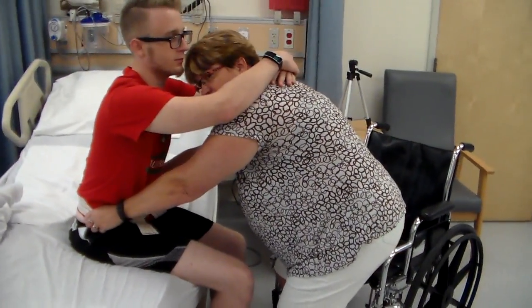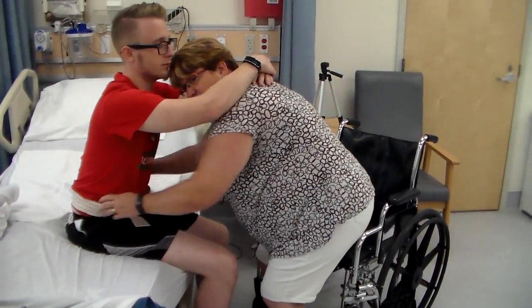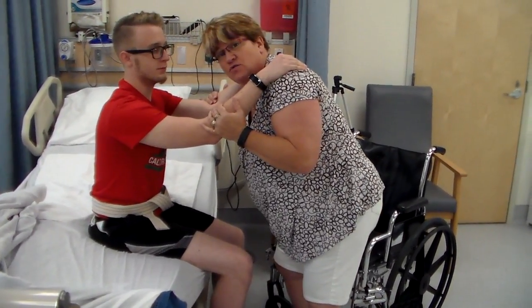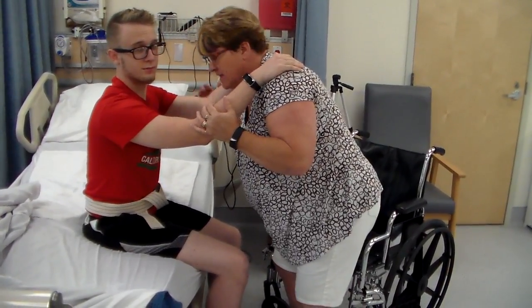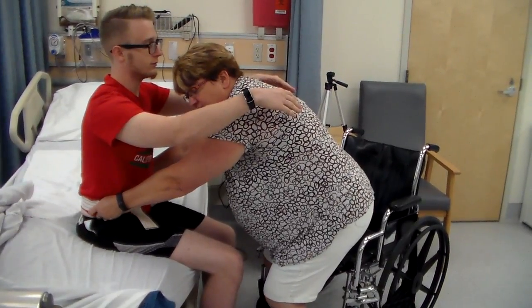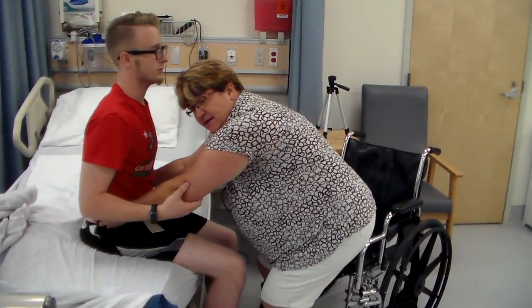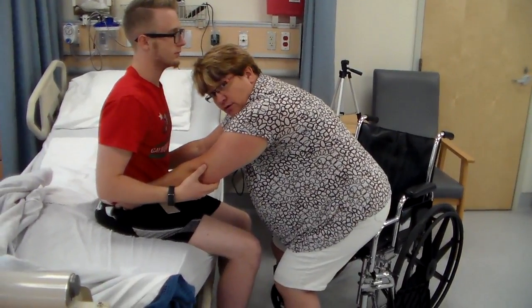Do I want a resident to do this to me? You're absolutely right, I do not. Because what's going to happen is when we stand and he's nervous, he's going to pull down, and now I have a hurt neck and shoulders and back, and it's just not pretty, okay? So if I put my hands here, then I'm going to tell him, go ahead and put your hands on my elbows. Right there you go. So what is that doing? It's stabilizing him. It's giving him something to say, okay, I'm not going to fall, okay?